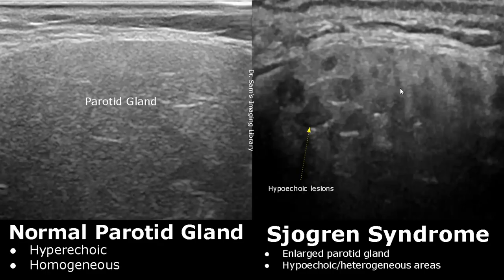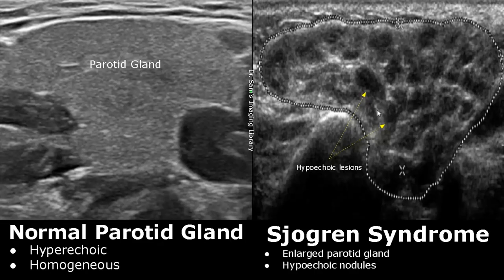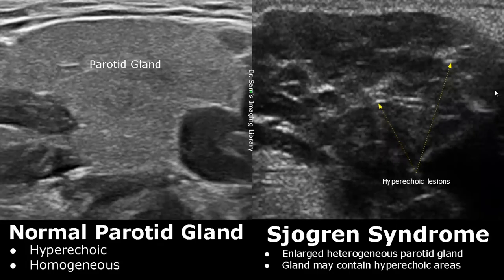Here is another image of Sjogren's syndrome. We see many hypoechoic nodules within an enlarged parotid gland. Usually the number of nodules increases over time. We may also find hyperechoic areas within the gland, which are usually due to fat deposition within the affected gland.